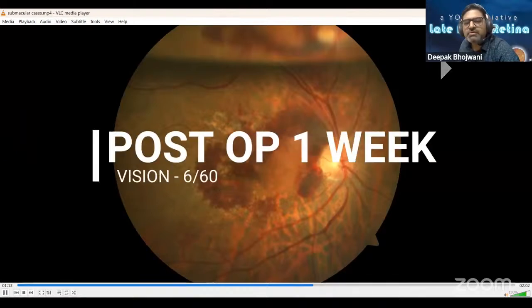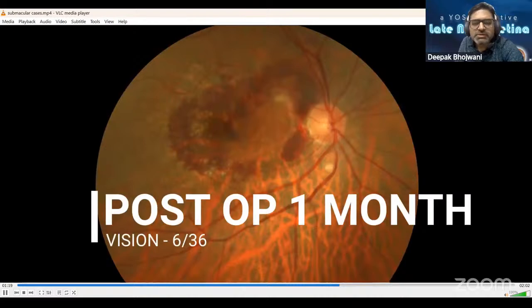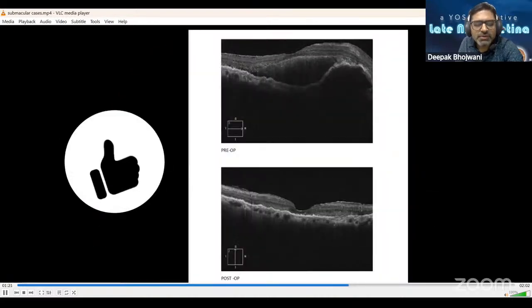Post-operatively, in 1 week, the patient has started gaining vision, and you can see the meniscus of the gas. At 1 month, the patient has improved. And on OCT, what I want to highlight is, whenever you are dealing with submacular cases, there are two components which you should be worried about. One is subretinal hemorrhage. You can always displace subretinal hemorrhage, but a sub-RPE hemorrhage you won't be able to displace. So whenever you have primarily a sub-RPE hemorrhage, this technique of pneumatic displacement may not work. Pneumatic displacement usually works when it's predominantly a subretinal hemorrhage.